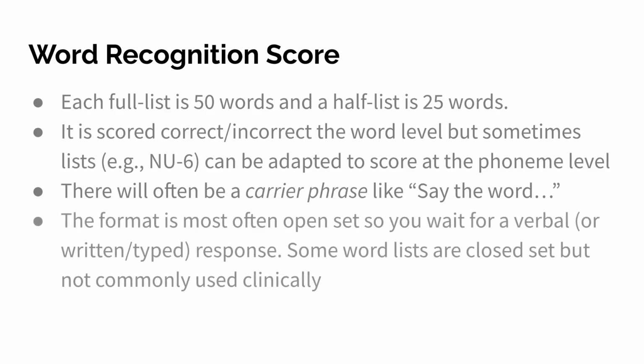The format is most often open set, so you wait for a verbal, or in some cases a written or typed response. Some word lists are closed set, where they have maybe 4 words to choose from, but they're not commonly used clinically.